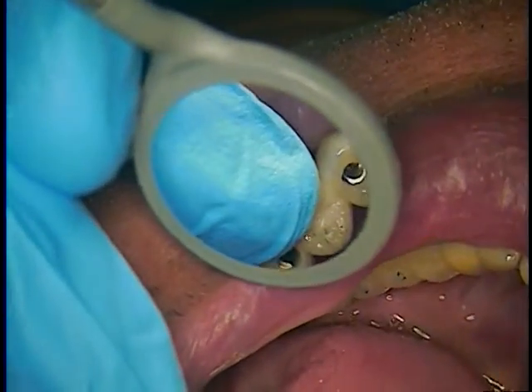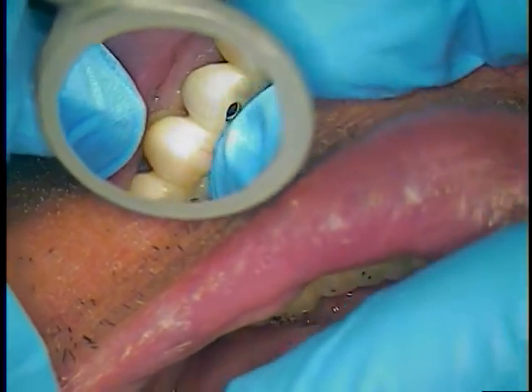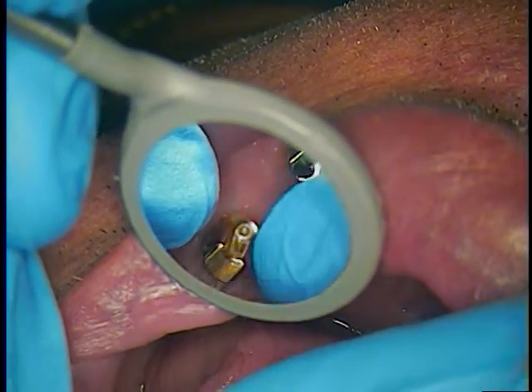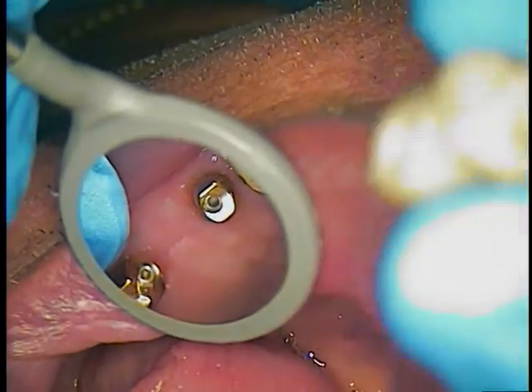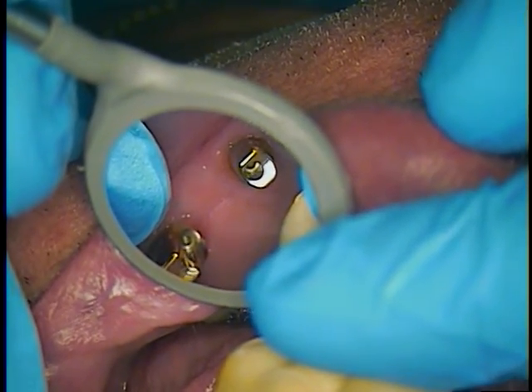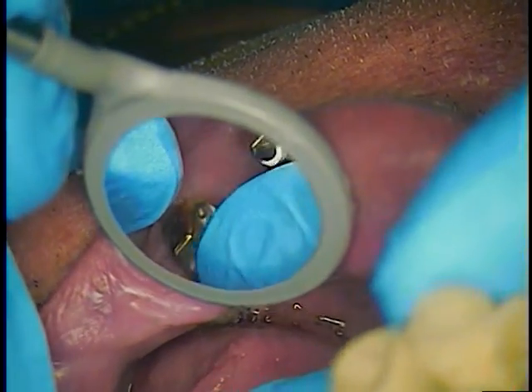All the checkpoints are going to make your next appointment nice and easy. Color-wise, I think we're pretty close — very nice. Now pop it out and take these out. The screws are lasered into the abutment, so they don't come out individually; the screws always stay attached to the abutment, so you have to be very careful. That's why we do it in two pieces, because we really don't want to glue this together and find out we have all these issues, and then have to have the lab put it back in the oven to get the glue undone — that oxidizes all the metal and that's not good.